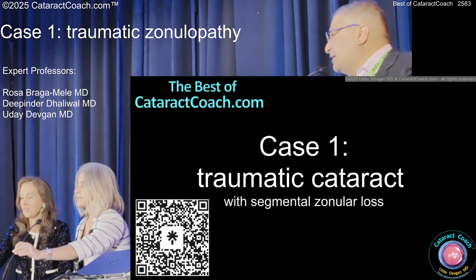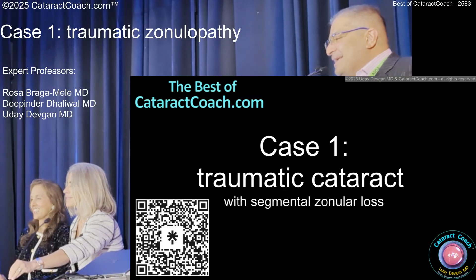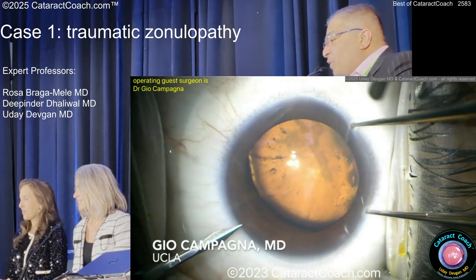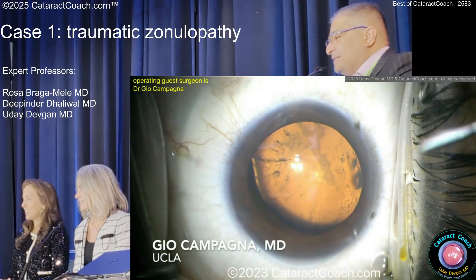All right, here's case one. We missed the audio, but CataractCoach.com. Now watch this case right here — this is an important one. We're going to move fast here. We had a former UCLA resident doing this in residency. So what do you notice here going on in this case?